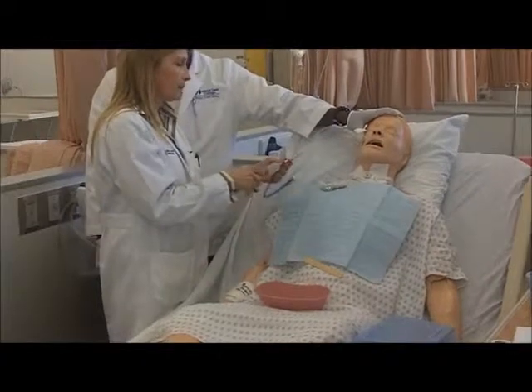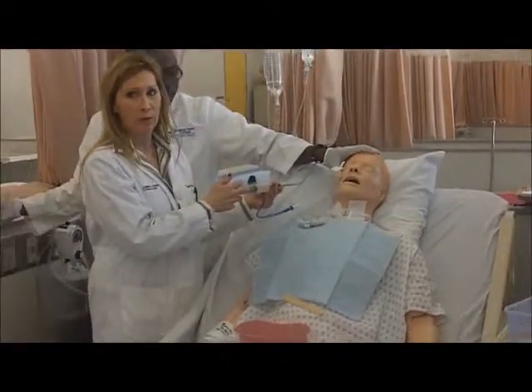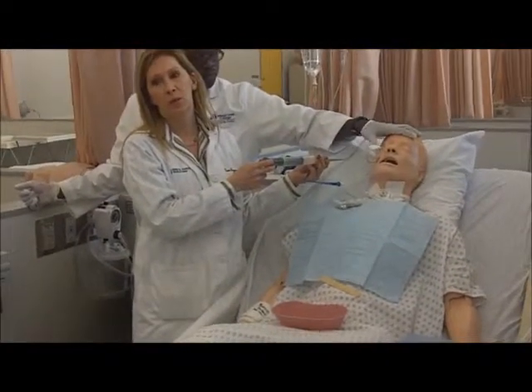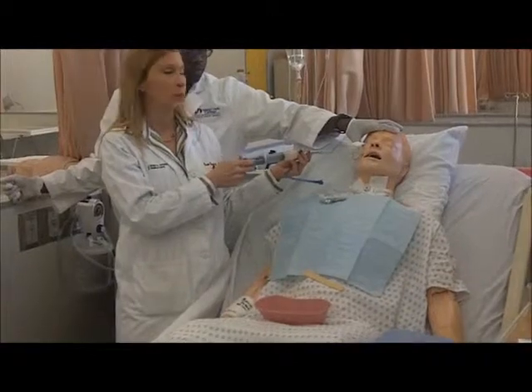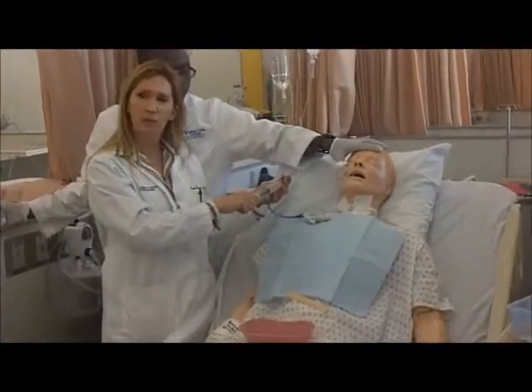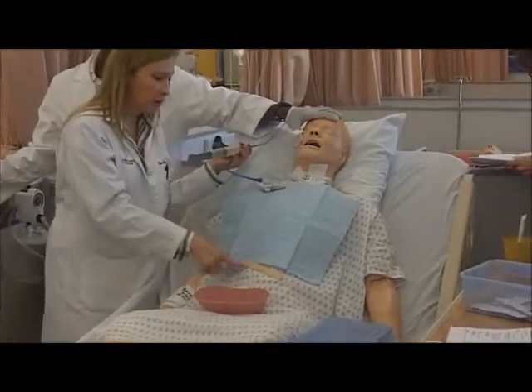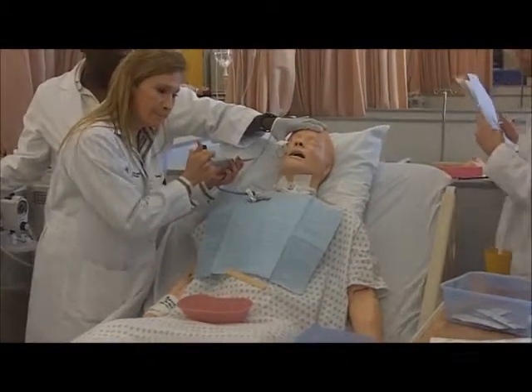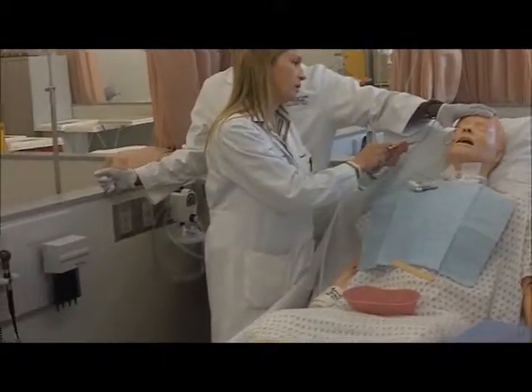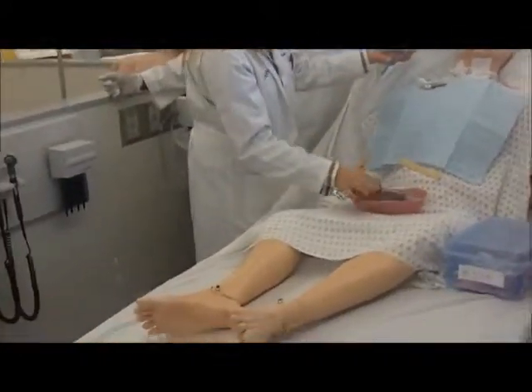So you don't aspirate before you do that? I never aspirate first, I usually do an air bolus first. Even when I'm checking placement on my patients every morning, and when you do your 12-hour shifts in the hospital, you need to check for placement. I don't push anything in. You can aspirate to see if anything green's coming back, but I usually put my stethoscope on here, and then I do a bolus. Okay, I'm in. Remember, I need to clamp it because there's gastric contents coming out. So now I know that it's in place.